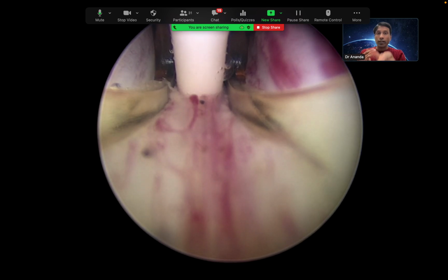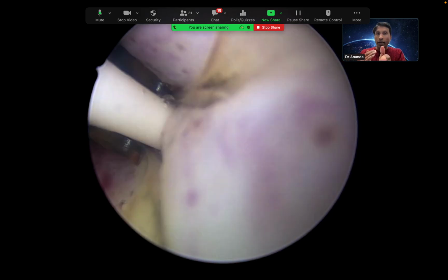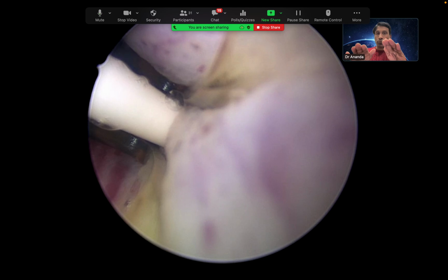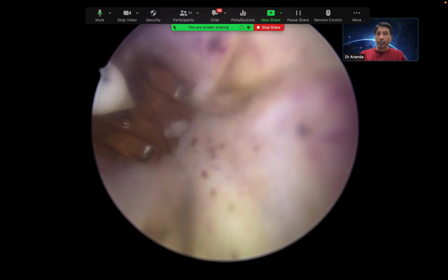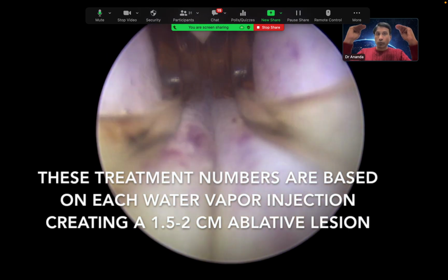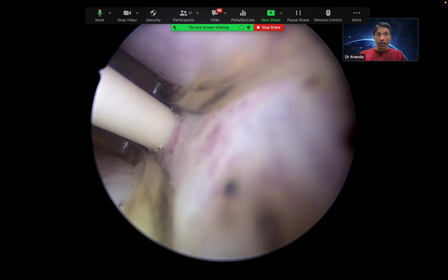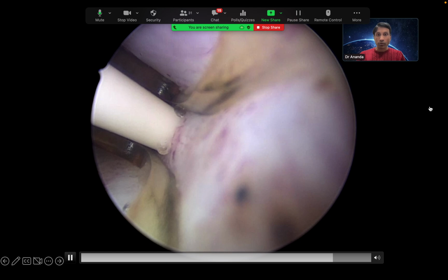Similarly, for treatments at 6 o'clock, they are now avoiding it to prevent unnecessary injury to the rectum, and the lower part is left alone, which protects the neurovascular bundles. It's quite common that the treatment is done only in the upper half, almost similar to the Urolift. I will try to show some post-op images.